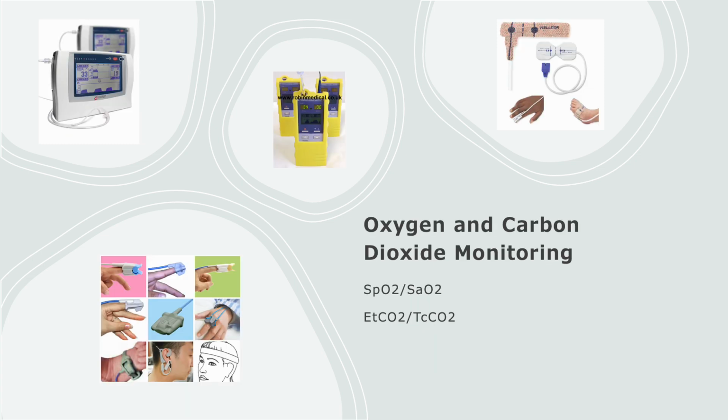For monitoring oxygen, we use pulse oximetry, which you might see as SpO2, which stands for saturation of peripheral oxygen. Peripheral because it's on the extremities, on the finger or on the toe, and away from the midline of the body. You may also see SaO2, which means saturation of arterial blood oxygen, but it's the same thing. Arteries are the vessels that carry oxygenated blood through the body, and an infrared light shines through the probe and through the finger. The amount of light that comes through on the other side is measured on the other side of the probe and converted into a signal, usually percentage.